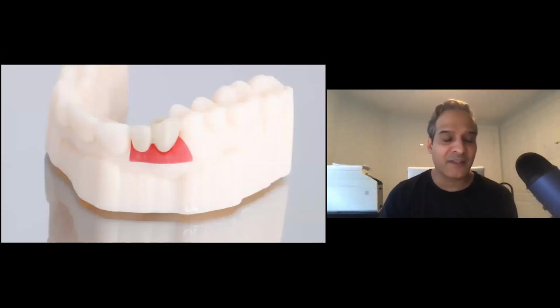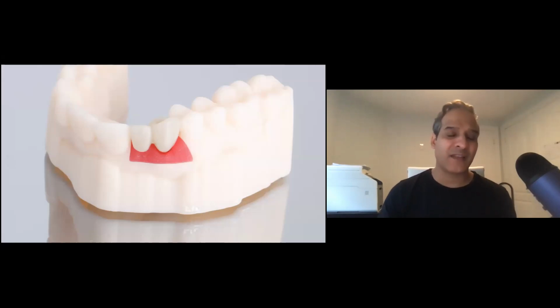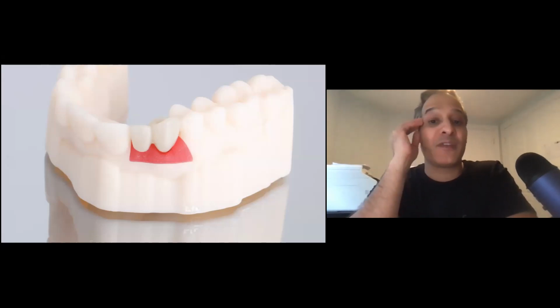I then took a scan of the implant, and I wanted to start the tissue shaping, because in my office, whenever someone sends me an anterior aesthetic case, I always do the provisional and shape it unless they tell me otherwise, because I basically want to hand it to them as a slam dunk. Basically I make it dummy proof. I say, okay, I've done everything. I've done the provisional. All you have to do is take an impression and get a good lab. I even insist that they have the patient see the ceramist to sit there with them and get the staining and the color perfect.